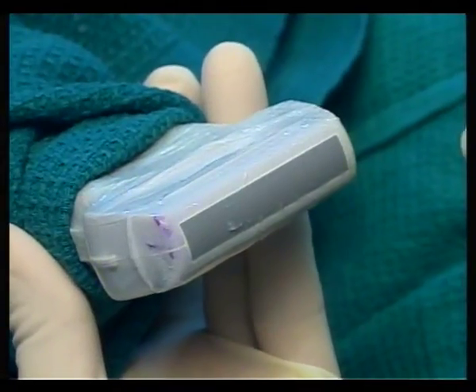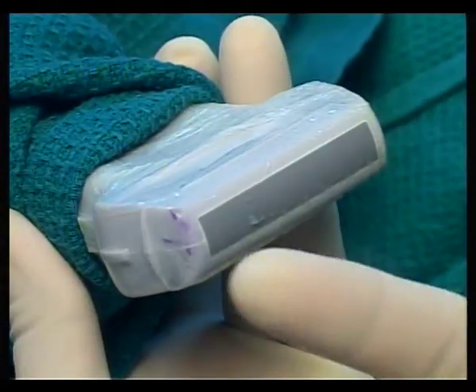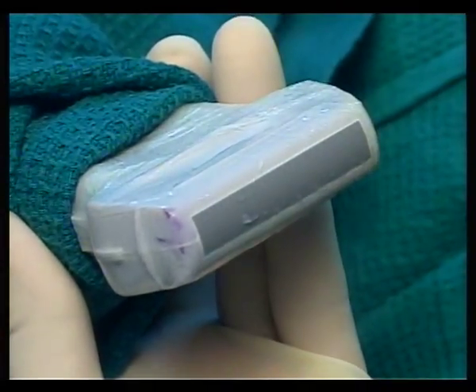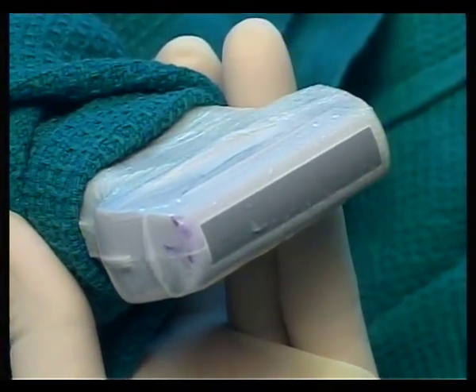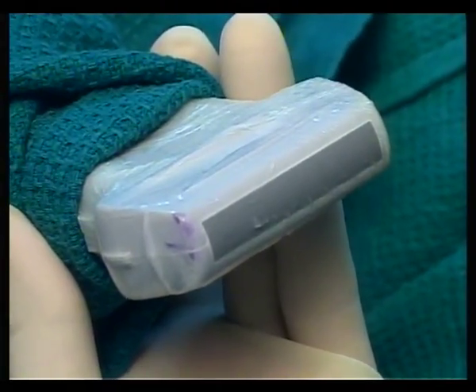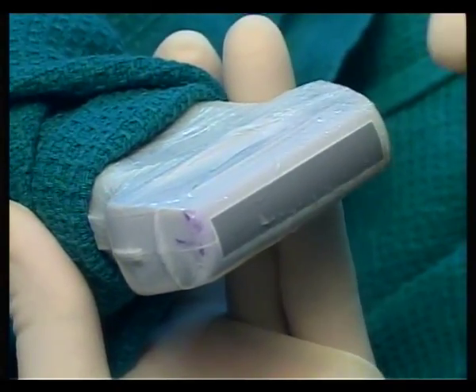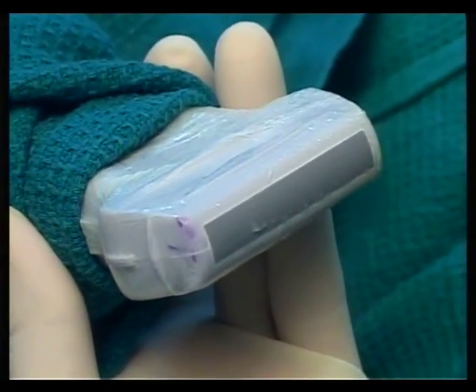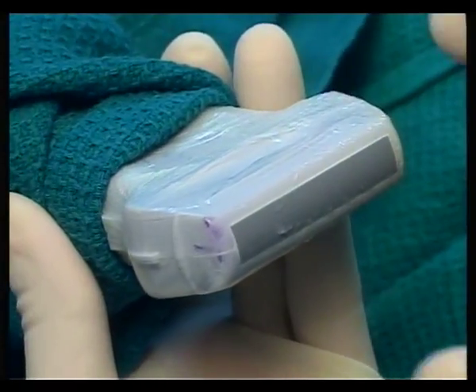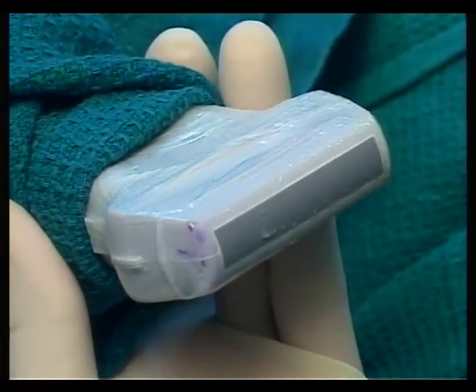This is a linear array probe. 'Linear array' means the transducer head is absolutely straight, so the sound waves generated by the piezoelectric crystals are sent in parallel, and whatever reflected waves the transducer head receives are also near-parallel — forming the image.